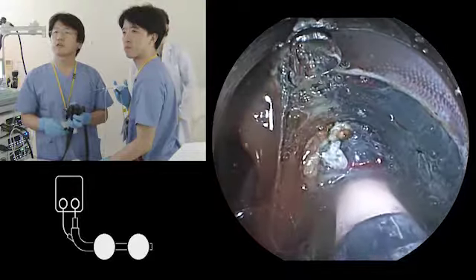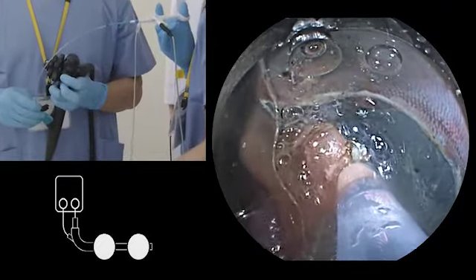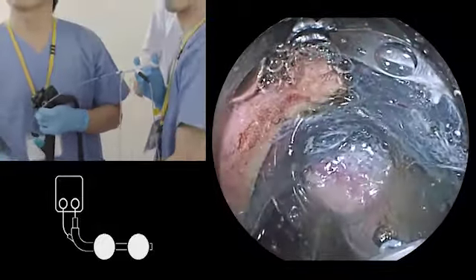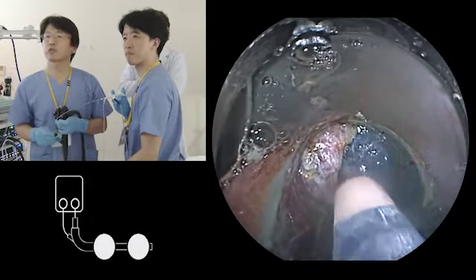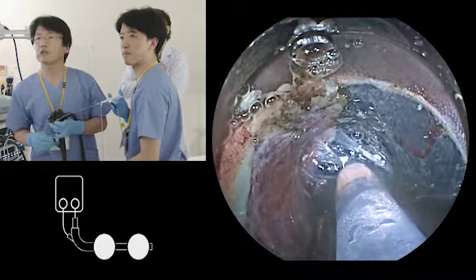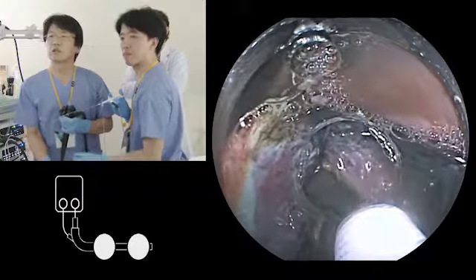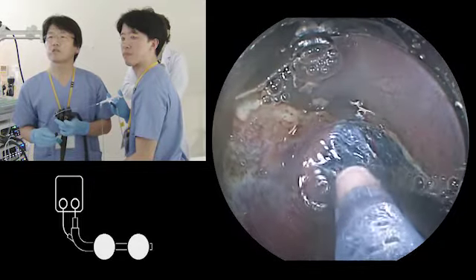And here is the blood vessel. So I coagulate, then cut it. So even at this moment, you don't perform the full marginal resection of this right side? No, because the situation could become difficult. Once you make a mucosal incision and an area like an island is left and the submucosal fluid is lost, then the dissection becomes very, very difficult. So that must be a very important tip. Yes. So the intact mucosa makes the situation very easy.